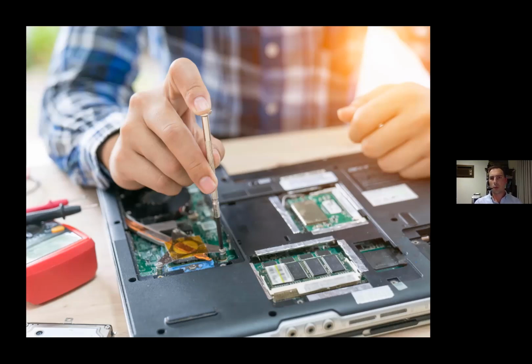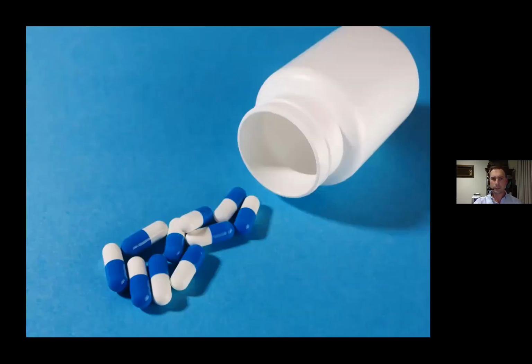When you compare shockwave to an intervention like a cortisone injection, in that first 4-week period, cortisone, because it's a potent anti-inflammatory, can have more of a pain relieving effect, but shockwave does do better at the sort of 3-month, 6 months, and 12-month period. So you explain to patients, and most patients don't want a quick fix. They want to get things better. They want a longer lasting effect. And that's been shown in the literature. I also talk to patients about shockwave being like a course of medication.